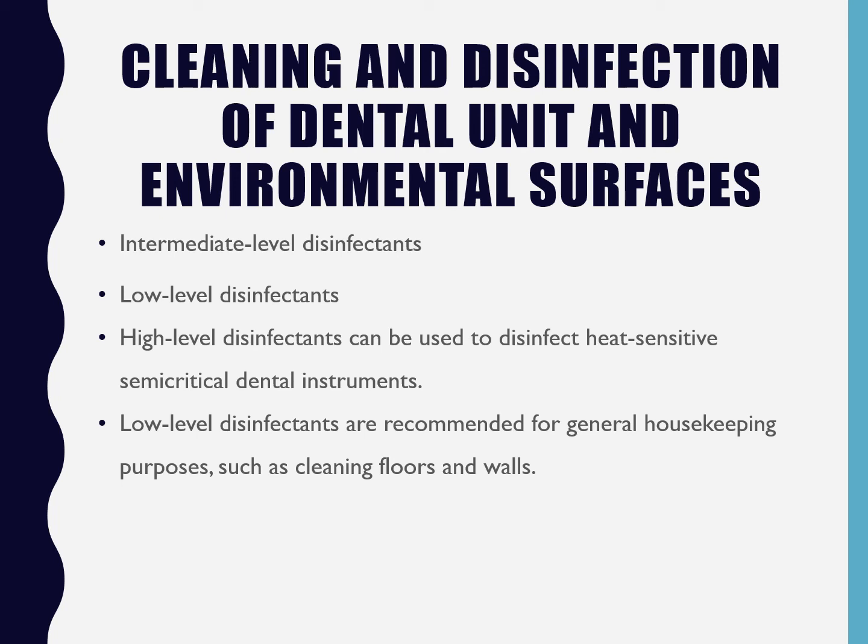And I'm like, no, things that go inside someone's mouth are semi-critical. They need to be sterilized in between. Then they let me know that they only put them in the cold sterile overnight, and during the day, in between patients, they just wipe them down. That was the only time I ever walked out on an office and didn't finish the day, because it would be on my license if I were purposefully, negligently, knowing that I was not properly cleaning the things between patients.